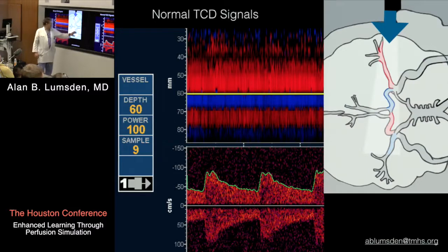If I'm doing a carotid endarterectomy, what I care about is the action that's going on upstream here. Let's say I'm doing carotid endarterectomy on this side. And Zolt's got his probe on there, and he tells me the flow velocity. So what you do here is, this is the surface of the head, this is the midline, right there. So that is the ipsilateral anterior cerebral. This is the ipsilateral middle cerebral. Red is the contralateral anterior cerebral, okay?